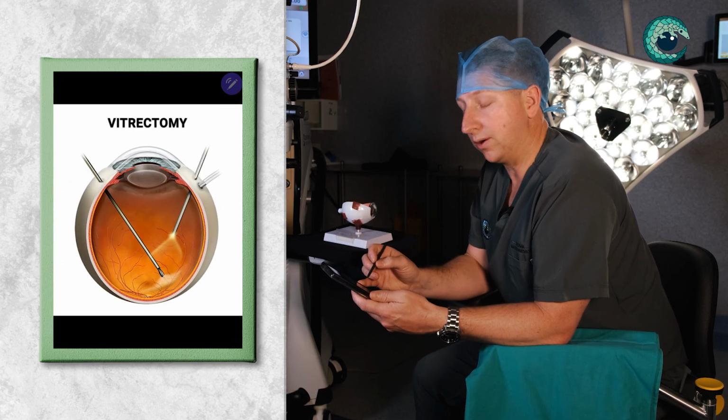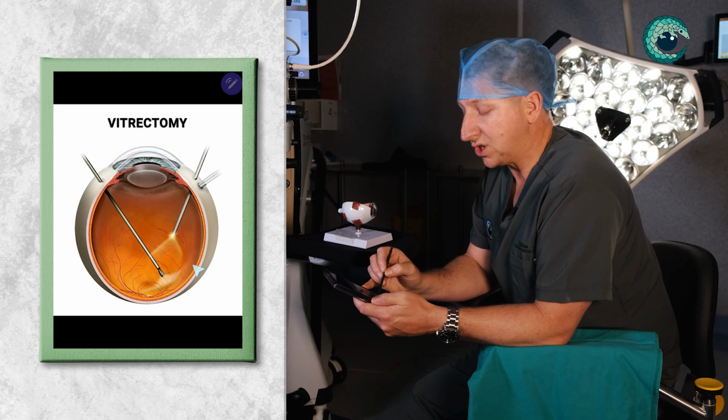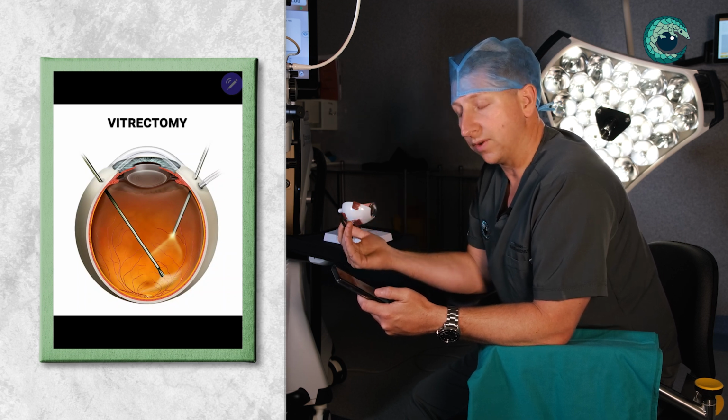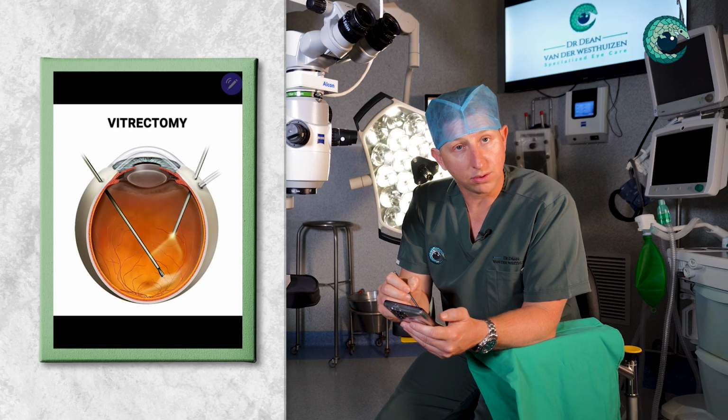During the surgery, we first remove all the gel at the back of the eye, and then we can address or fix whatever issue we want to fix. At the end of the procedure, we pull all the instruments out.